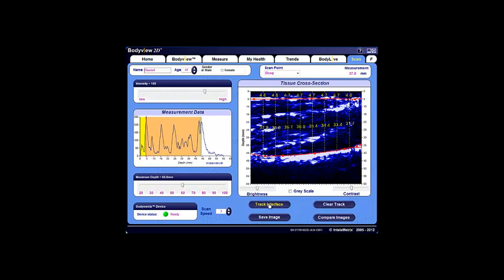We have now quantified both fat and muscle thickness. The white signal we see within the muscle typically represents intramuscular fat or other tissue structures such as connective tissue or veins, so you can potentially look at the quality of that muscle as well. The contrast slider allows you to adjust the amount of blue signal displayed, and moving it up reduces it.